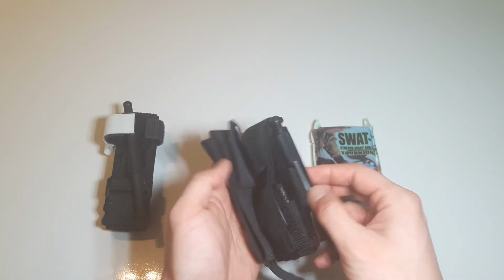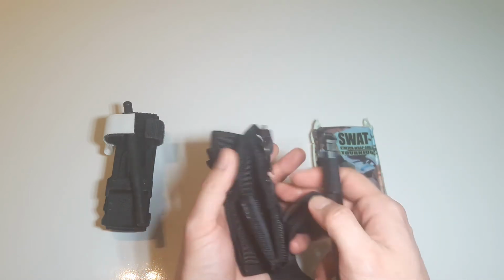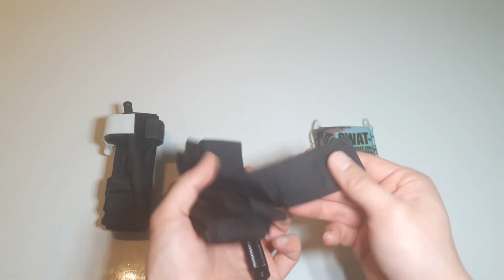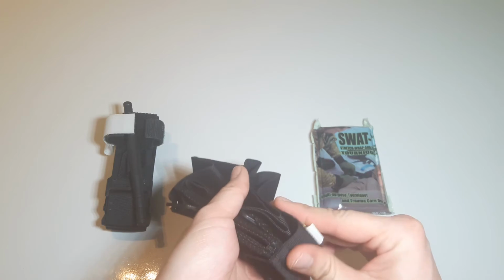I actually bought this one in Korea from a Korean website, and it wasn't advertised as a SOF-T tourniquet anywhere, even though it looks exactly like one, so I suspect it's a fake, even though it cost about the same as a real one. It could just be an older generation one, but new ones should have a tag here with all the appropriate markings and trademarks.